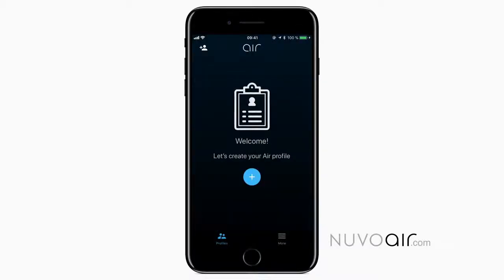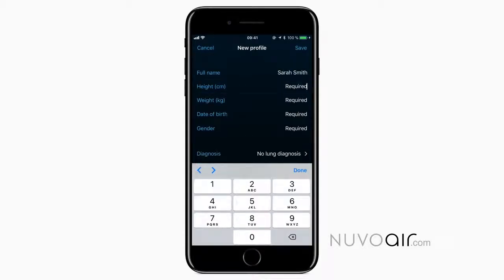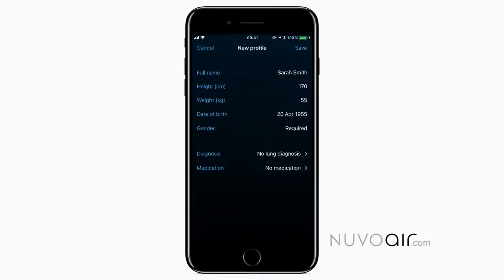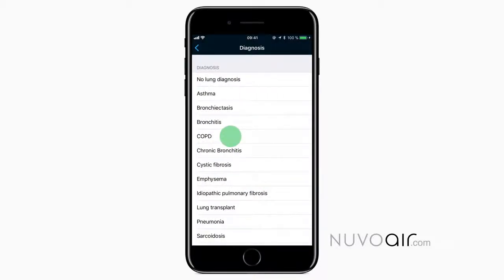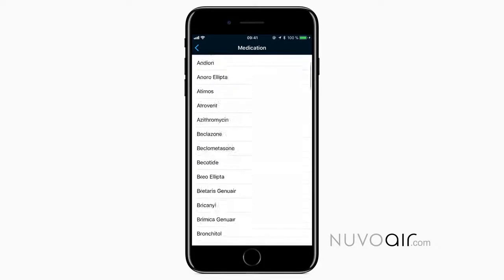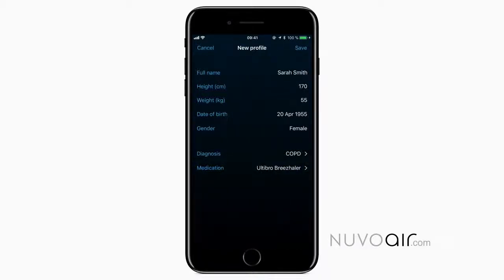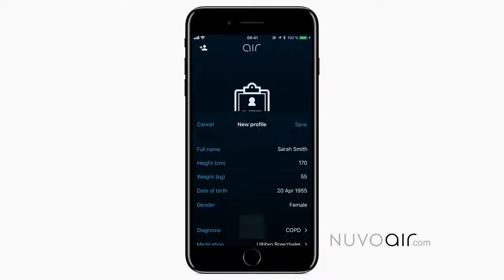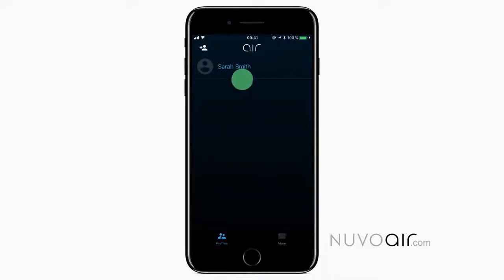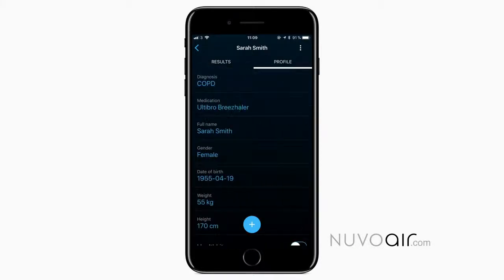Once your account is created, you are asked to set up a patient profile. You can update profile information at any time by going to the Profile tab.